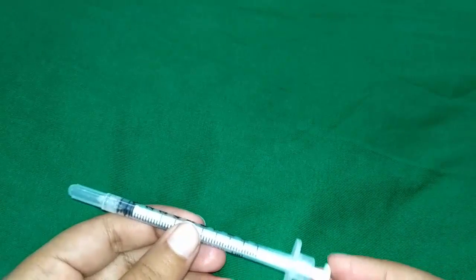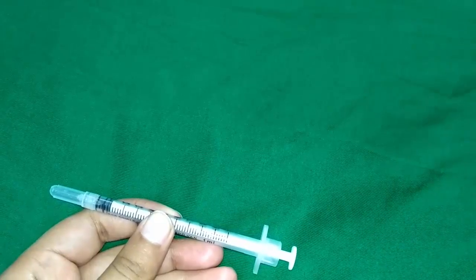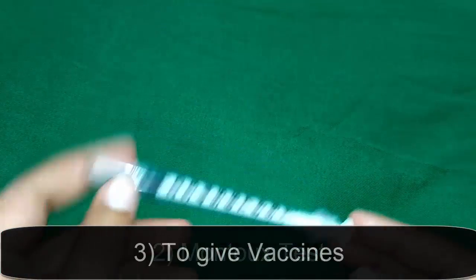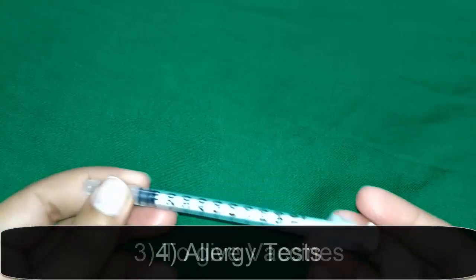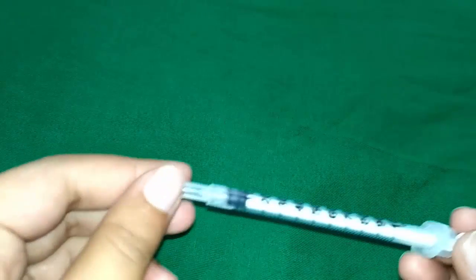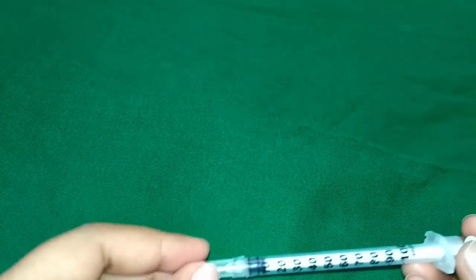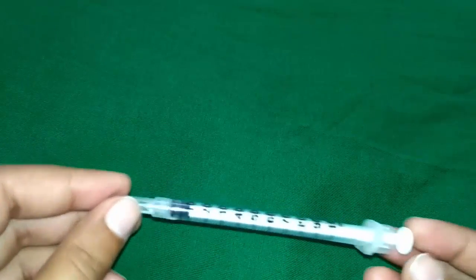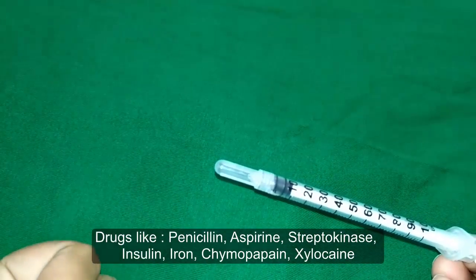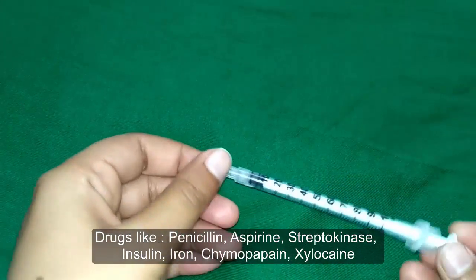Other uses of the insulin syringe include Mantoux testing, giving vaccines such as BCG, TT, DPT, or Hepatitis, and allergic testing. It is used to give an intradermal test dose — a small dose of medication used to determine whether the patient can tolerate it — for example, test doses of drugs like penicillin, aspirin, streptokinase, insulin, iron, chymopapain, and local anesthetics such as xylocaine.